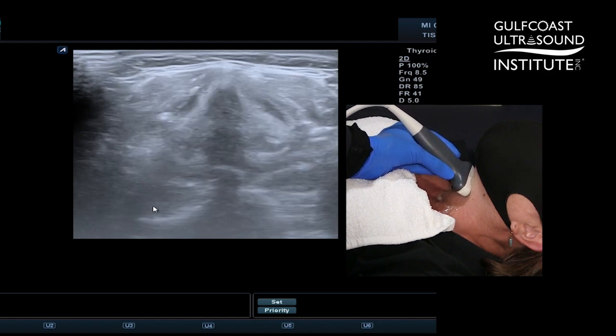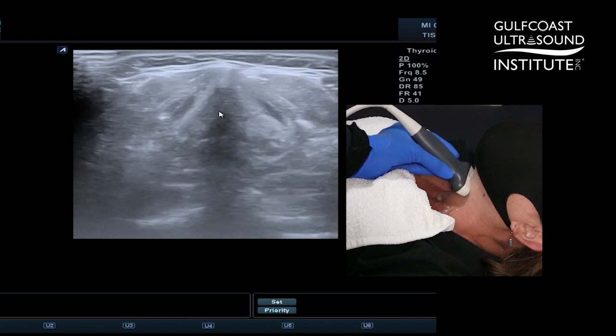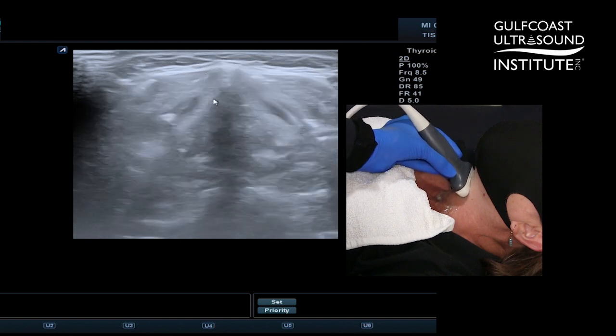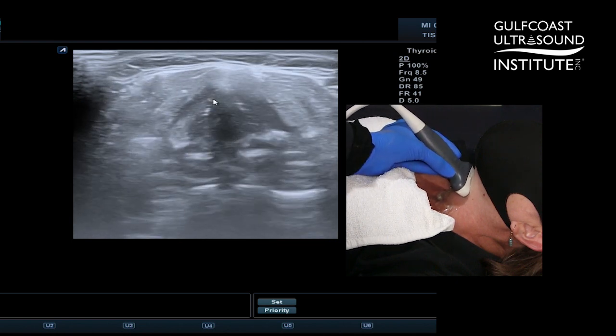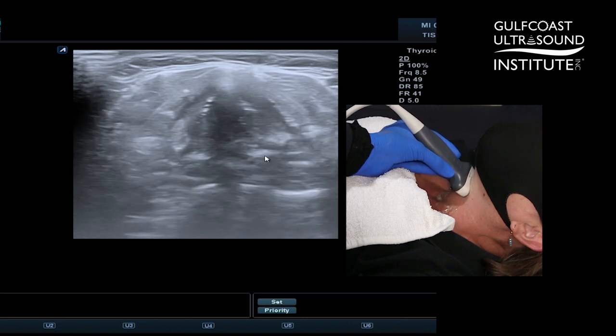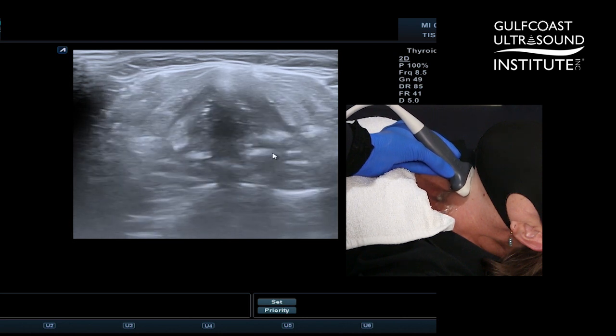The false vocal folds will appear as very bright symmetrical dense densities on either side of the midline. With passive respiration you should be able to see them moving symmetrically. These posterior densities are the arytenoid cartilages.